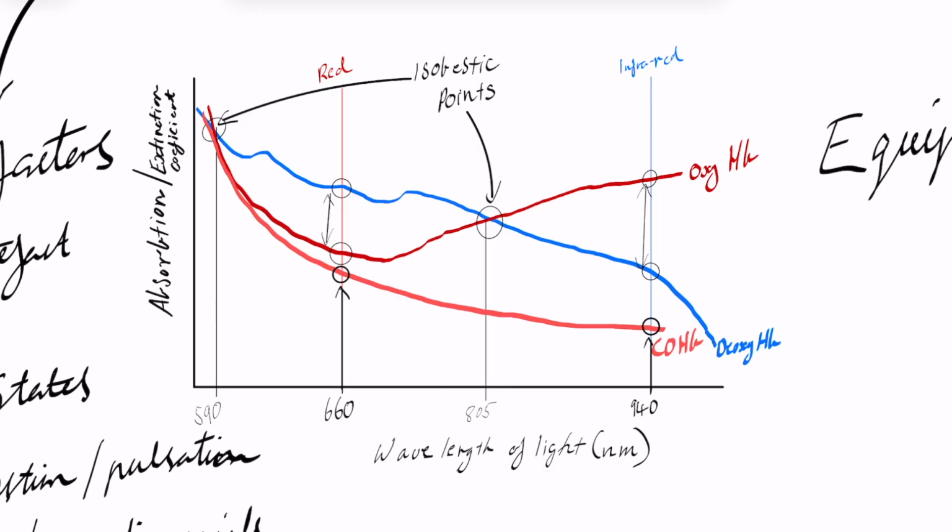But in the context of the R value, because carboxyhemoglobin will decrease both deoxyhemoglobin and oxyhemoglobin concentrations due to its high affinity for hemoglobin, the normally greater red light absorption of deoxyhemoglobin will be decreased, but the red light absorption of the combined oxyhemoglobin and carboxyhemoglobin species will be maintained or slightly increased.